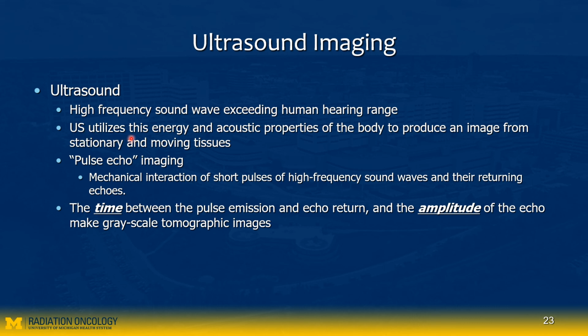Ultrasound utilizes energy and acoustic properties of the body to produce images, from stationary tissue like the liver or thyroid, or moving tissue like blood moving through your heart, or a fetus inside the mom's uterus.